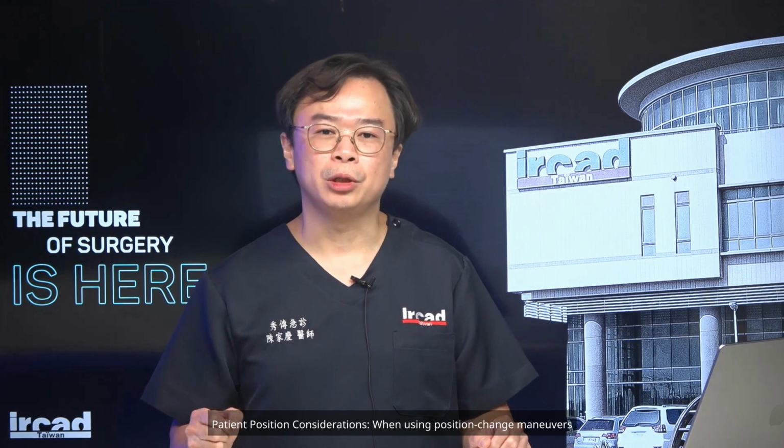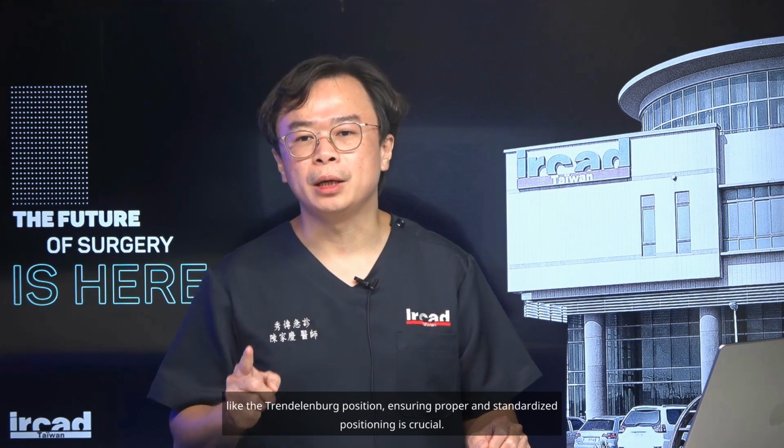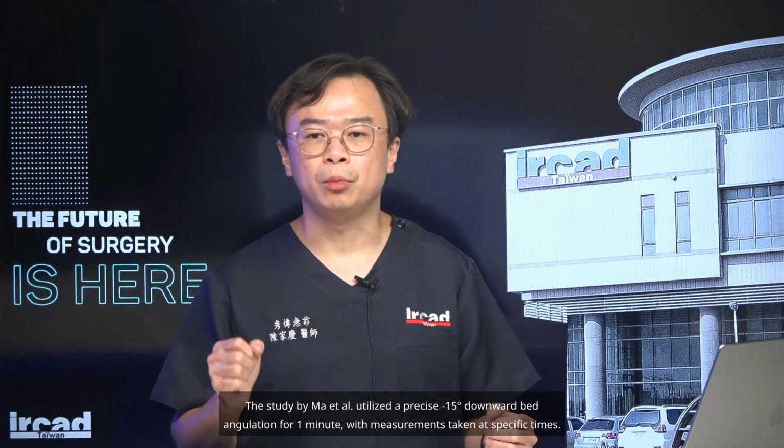9. Patient position considerations. When using position change maneuvers like the Trendelenburg position, ensuring proper and standardized positioning is crucial. The study by Ma et al. utilized a precise 15-degree downward bed angulation for 1 minute, with measurements taken at specific times.